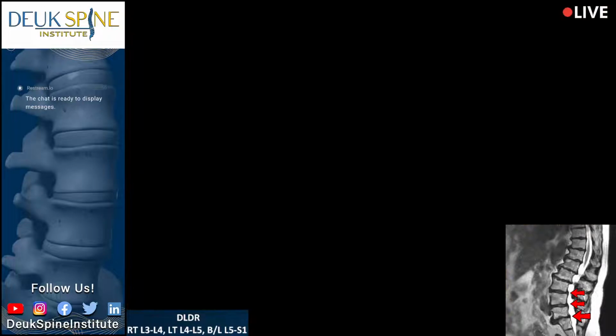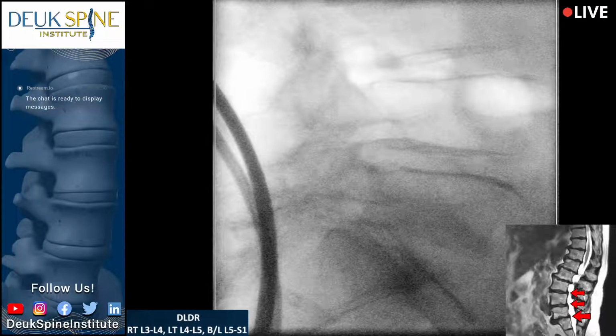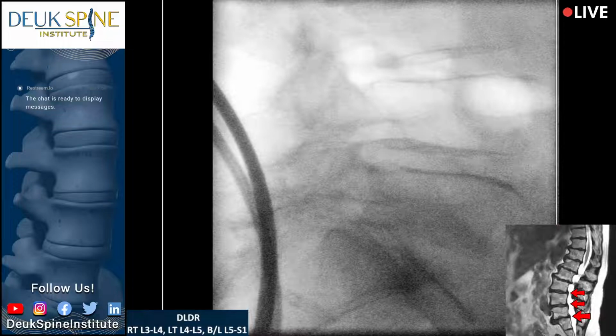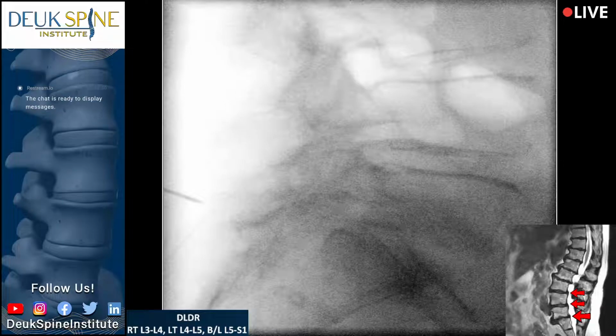We're going to use our x-ray machine. So what we need to do here is I need to see the back a little bit more. So open up the field of view in the back. Open your collimator, that's good. It's too far south is what I suspect. Shot, probably still too far south. Need to be a little bit further north.